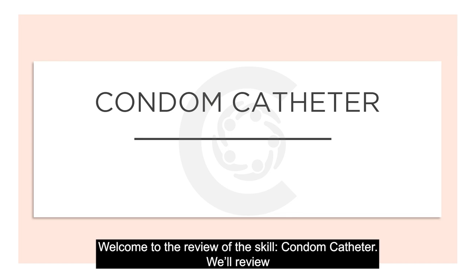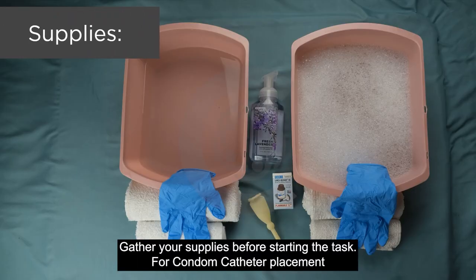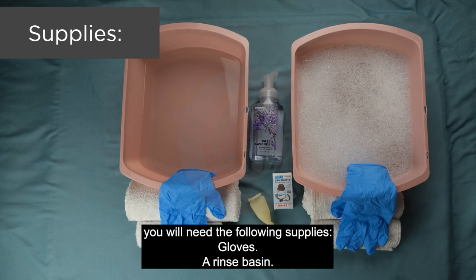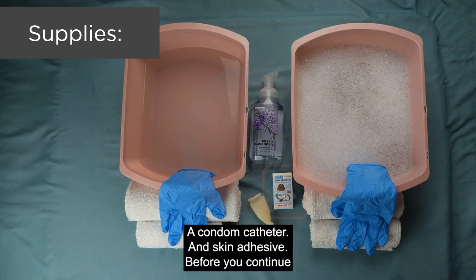Welcome to the review of the skill condom catheter. We'll review the steps of how to properly assist your client with placing a condom catheter. Gather your supplies before starting the task. For condom catheter placement you will need the following supplies: gloves, a rinse basin, a wash basin, liquid soap, a few towels, a condom catheter, and skin adhesive.